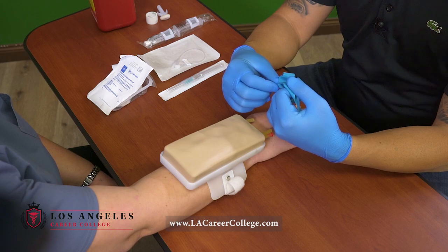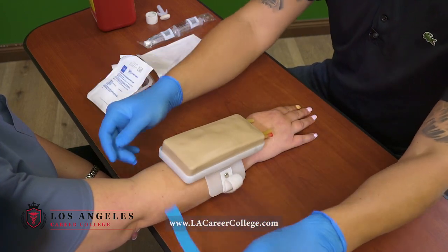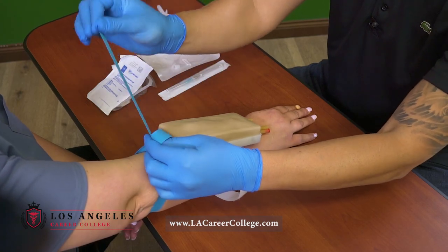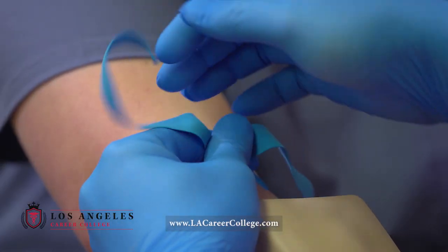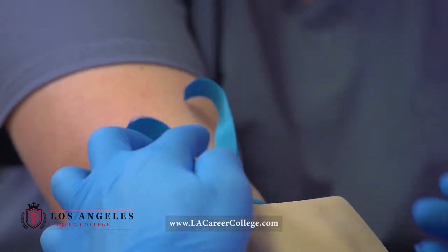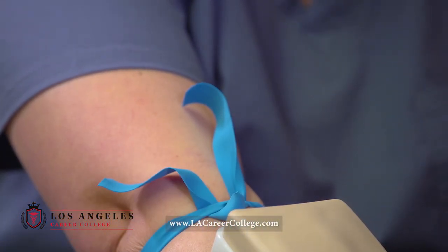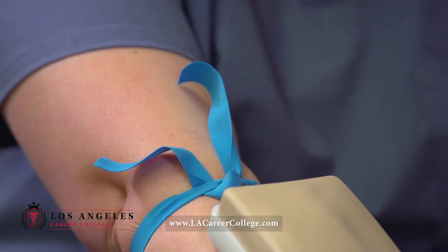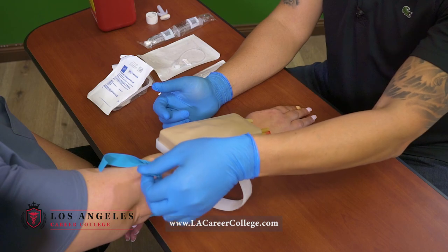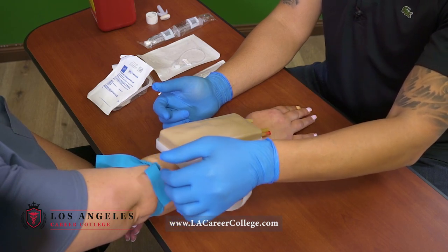Hi Terry, so I'm gonna go and start an IV on you. I'll tie the tourniquet — hold on one side, pull on the other. The flap facing me goes away again. It needs to be at least five fingers away from your IV site, and the flaps facing away needs to be a quick release as well.